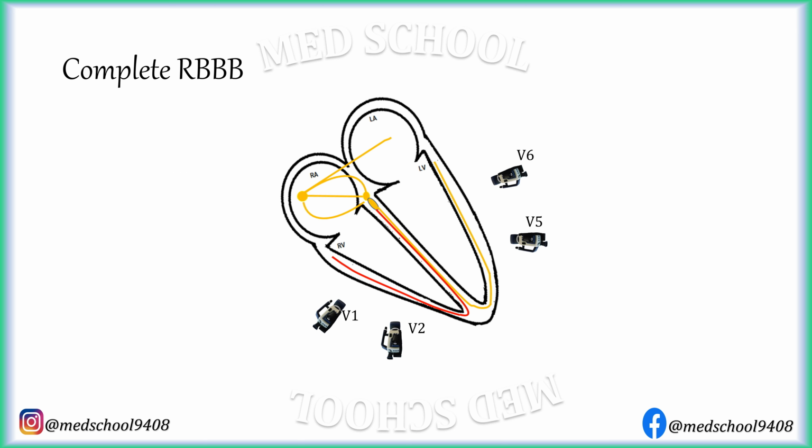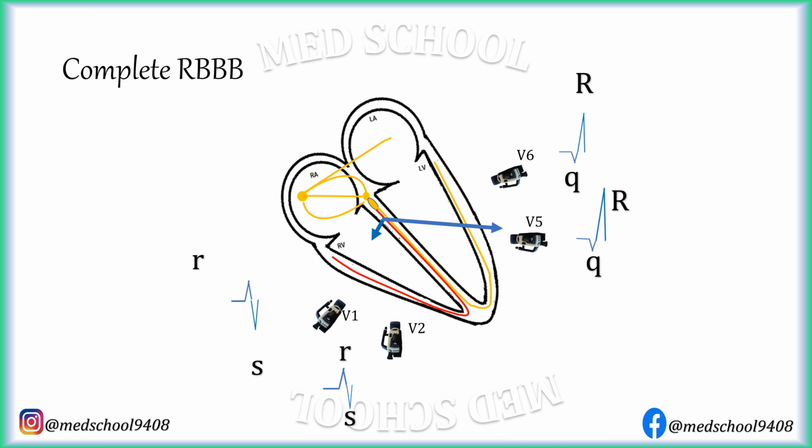In complete RBBB, septum is activated first as usual, as most of the septal fibers arise from left bundle branch. Septal vector will be normal and right oriented leads show small R wave and lateral lead shows Q wave. Next, left ventricle is depolarized normally through left bundle branch. For this vector, right oriented leads show S wave and lateral lead shows R wave.